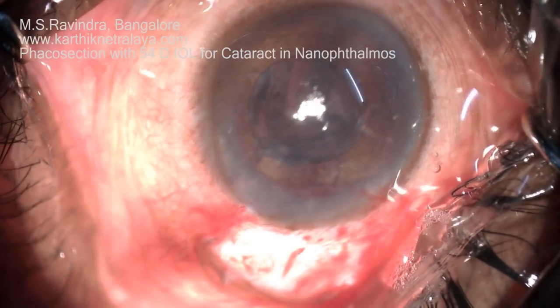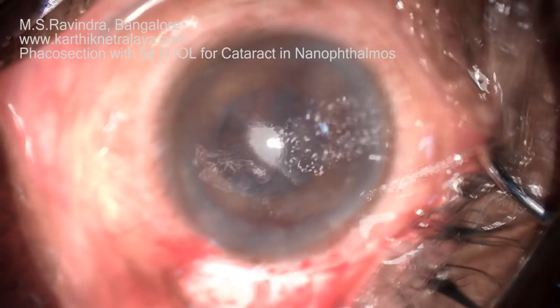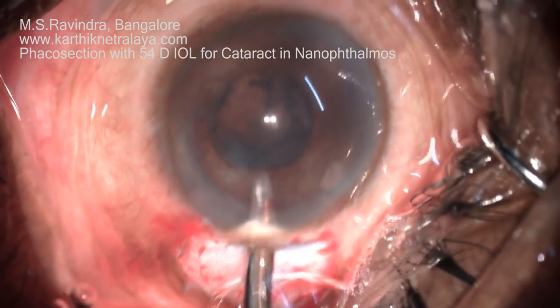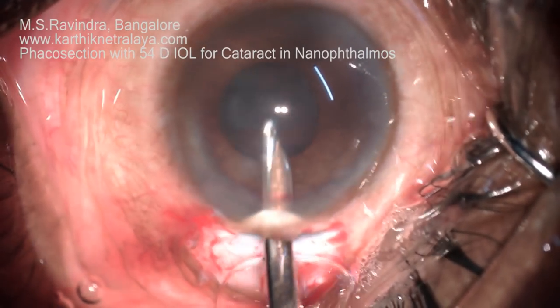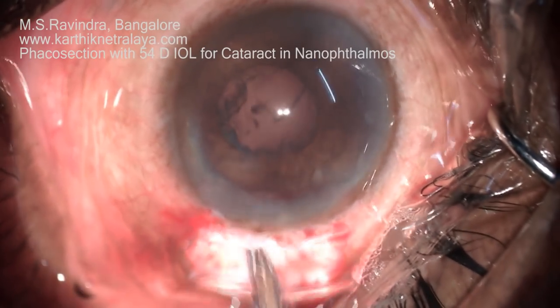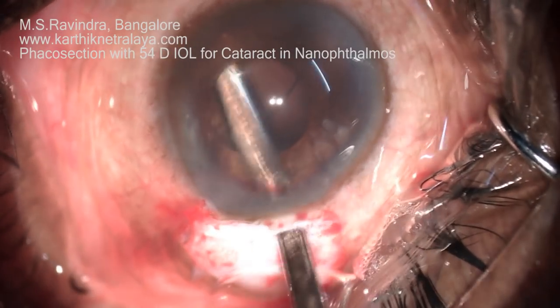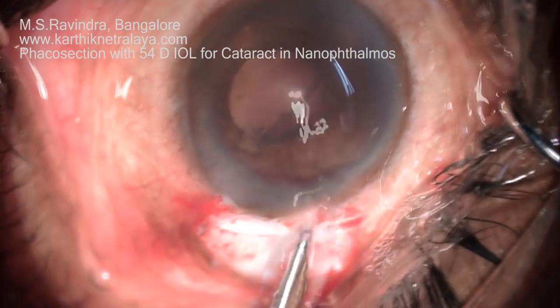The remnants of viscoelastic in the anterior chamber must first be removed to prevent movement that can affect endothelial integrity. The cortex is easily aspirated with a Simcoe cannula — straight as well as right and left reverse Simcoe and J-shaped Simcoe cannulas are utilized.